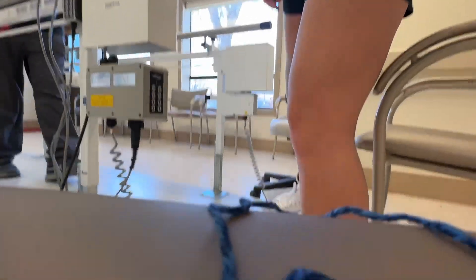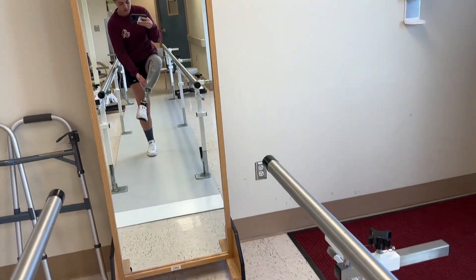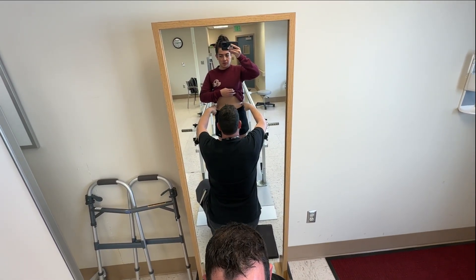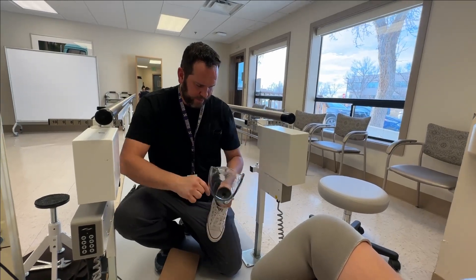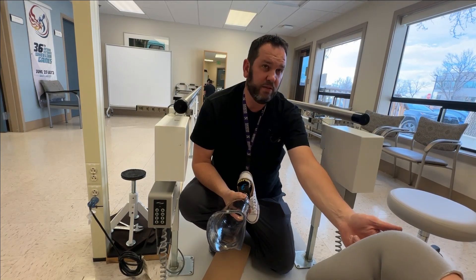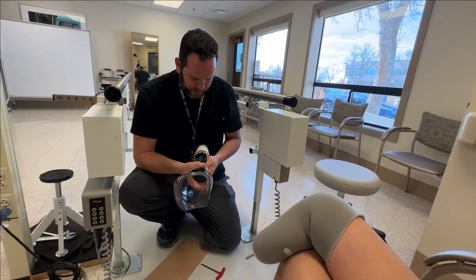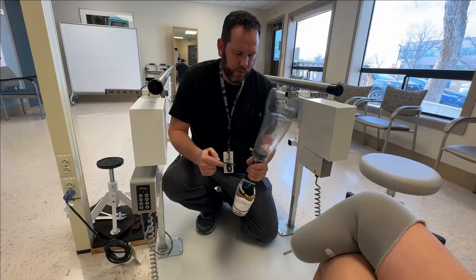We can't hide it with this. Is that side to side or front to back, or just all around? It's just like all of it feels loose. This one's a quarter. Now when you're standing, I feel like that feels right. Was it pushing or pulling on any of the bony landmarks? The outside of the fib head here, the front of the tibia? I did not notice. You probably won't until we get a three-ply sock on. Because right now it's so loose, you're probably rattling around in there. Let me go grab a three, a five, and a one. Let's see where we're at with socks.